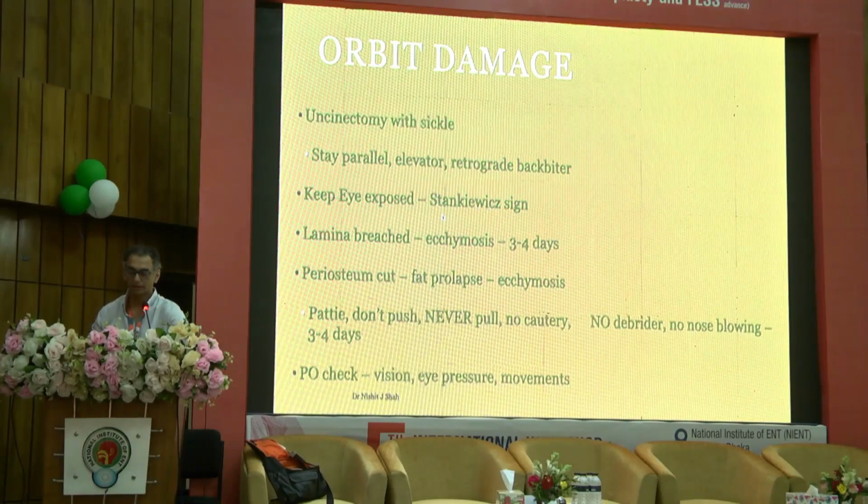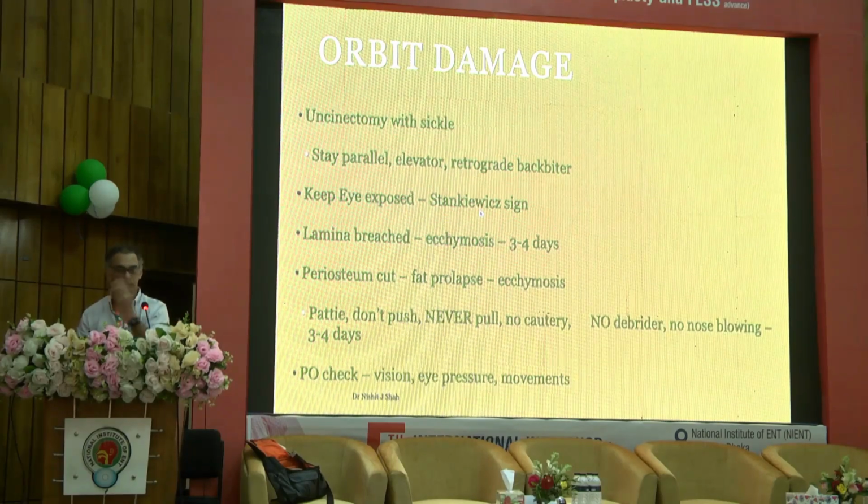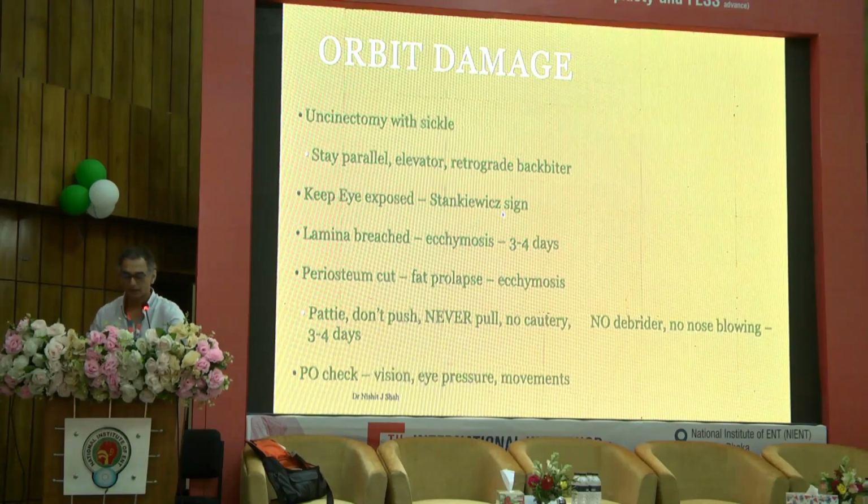While operating, always keep the eye open so you can ballot the eye, what was called then the Stankiewicz sign, to check if you got into the orbit. If it does happen, you tell the patient not to blow the nose so that you don't get subcutaneous emphysema, and 3-4 days of little bruising, and the patient is okay. Keep an eye on the vision, eye pressure, movements, just in case there's bleeding. But usually there's no problem.